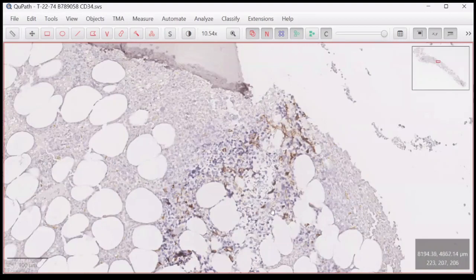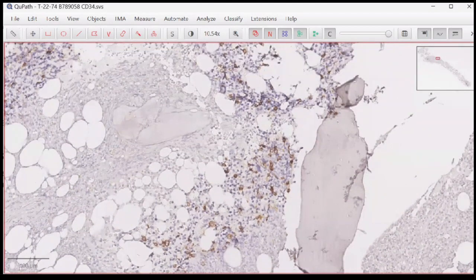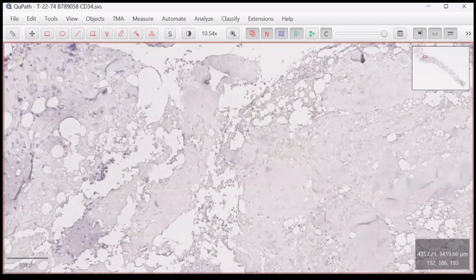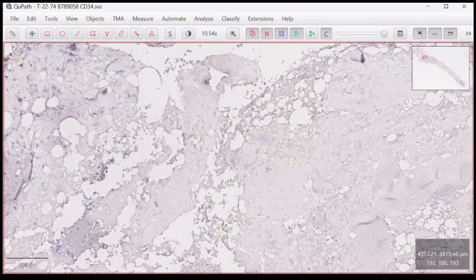But on whatever areas exhibit 34, they are all mostly individual cells. Only occasionally you have this two-cell cluster here. The remaining are individual 34. And if you semi-quantify from the previous one, there is a definite reduction in 34 positivity, probably now reduced by more than 80%, isn't it? Okay, 34. Now we check on the CD117.